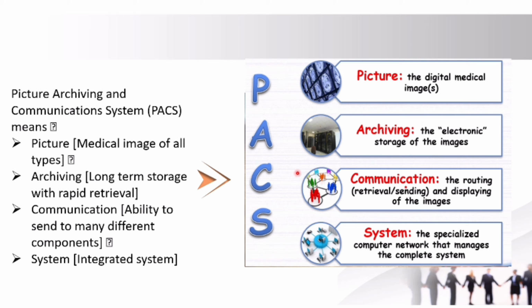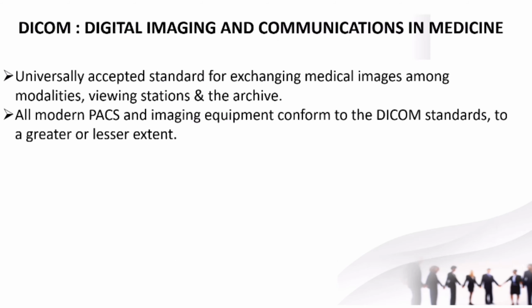Then C stands for communication. It is the routing, retrieval or sending and displaying of the images. And S stands for the system, that is an integrated system. From one system to another we can view the same images. We can send images to another system, and there also we can view the images.